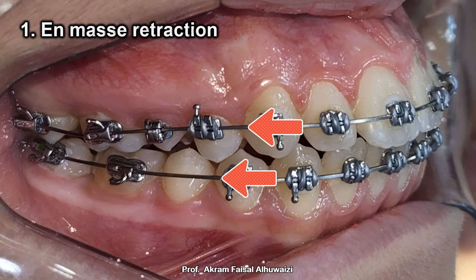Tip number one: I always prefer to do en masse retraction rather than to retract the canine first and then the incisors. First because it takes less time, and second because the appearance of the patient will be much better than when you retract the canine leaving the incisors alone. If I need more anchorage, I'll just put mini implants or TADs, but in most cases I find that just bonding the sevens is enough.